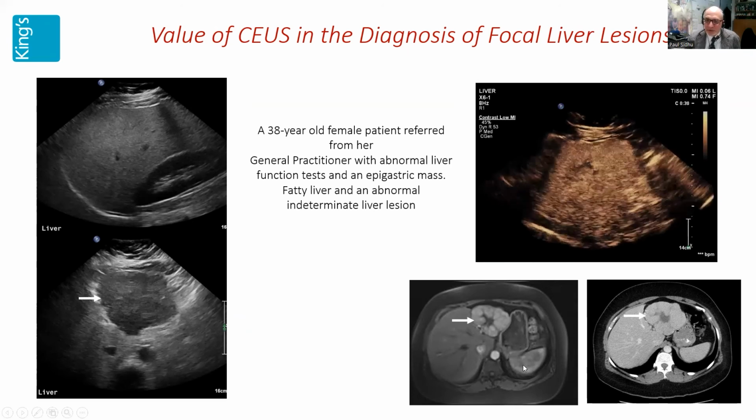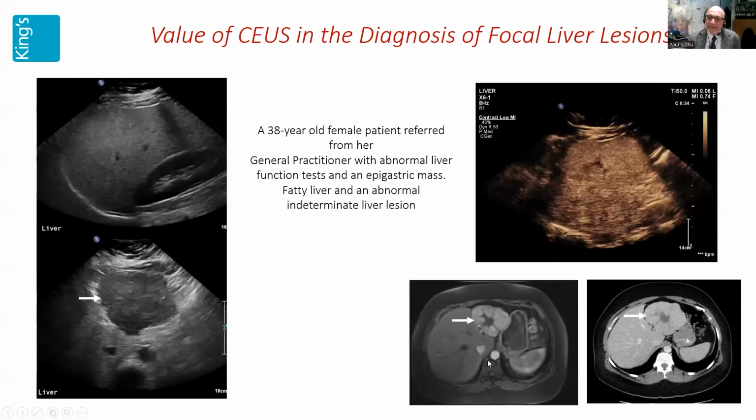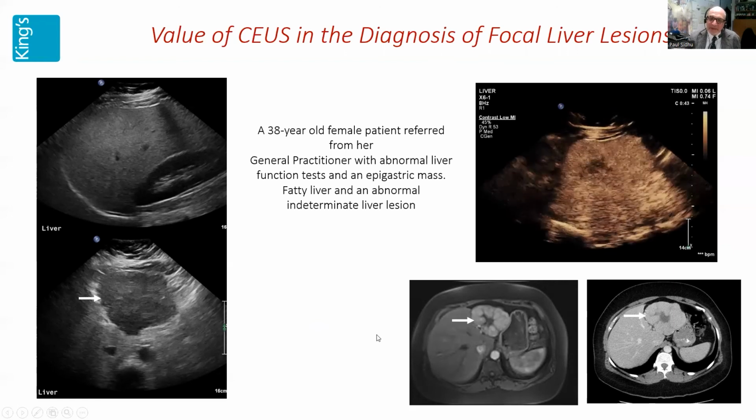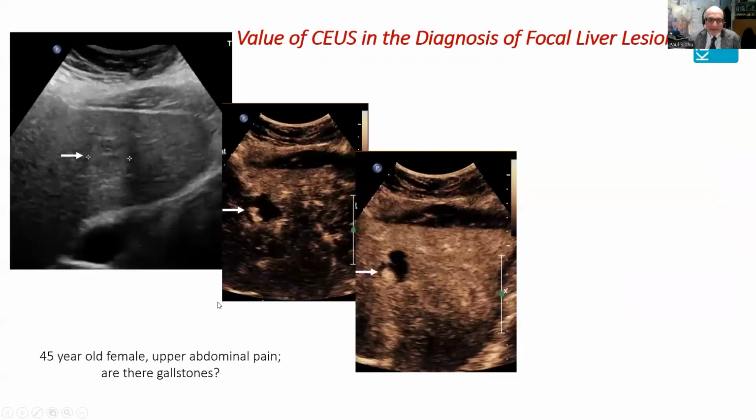This is a focal nodular hyperplasia. You diagnose this at the bedside immediately, but of course the physicians looking after this patient wanted further confirmation with more expensive studies, but over time this will change and they will understand and rely on your contrast-enhanced ultrasound appearances.